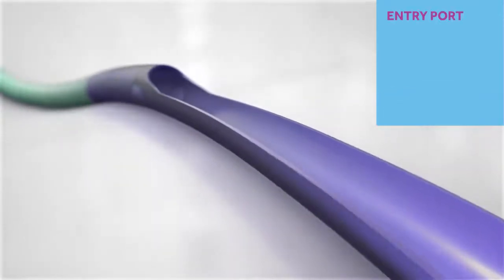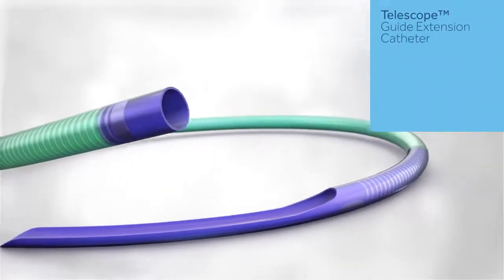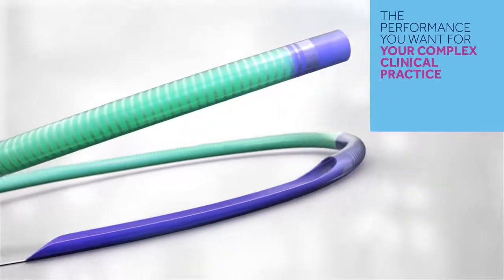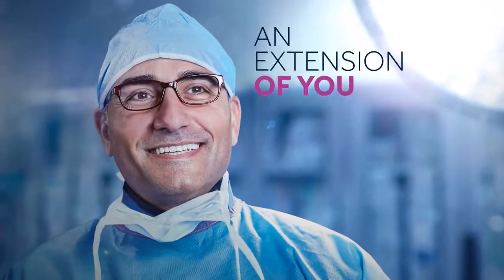The entry port contributes to smooth device entry and delivery. As PCI evolves, we're delivering the GEC performance you want for your complex clinical practice. Telescope GEC — an extension of you.